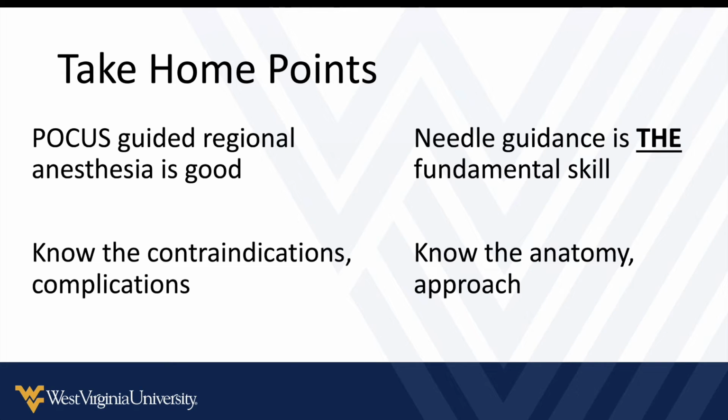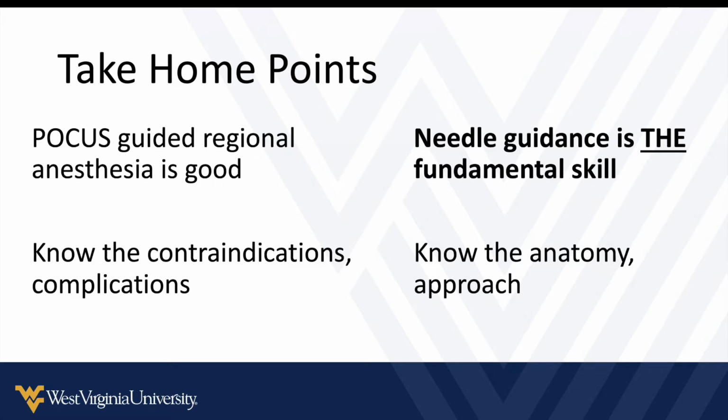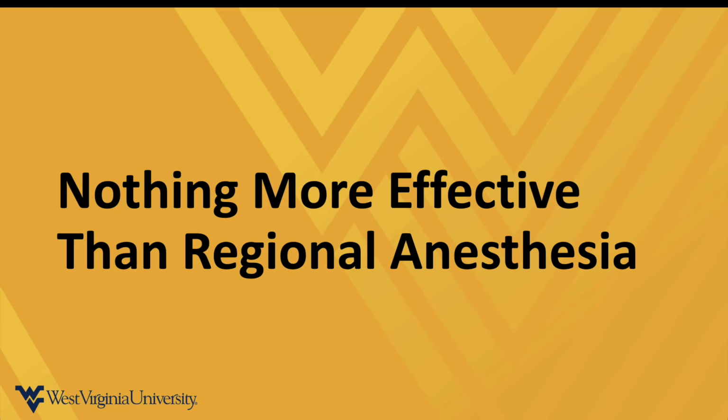Beyond that, we'll go through some of the anatomy, but if you can guide a needle, you can refresh yourself on the anatomy pretty quickly and then find the approach that's going to fit the situation you're in, just to emphasize that even further. And again, I want to point out, if you've got a body part that hurts, there's not much that's going to be more effective than a good nerve block or regional anesthesia.